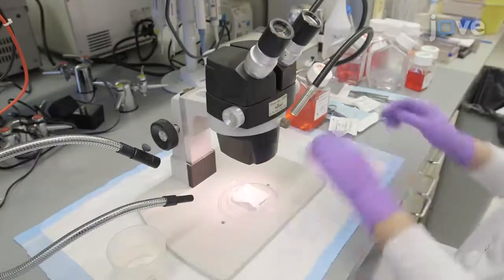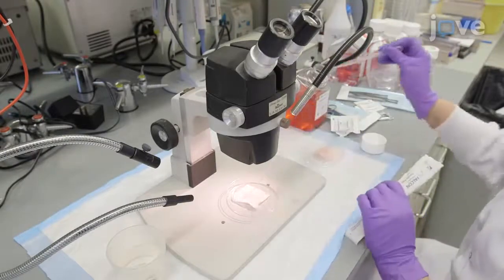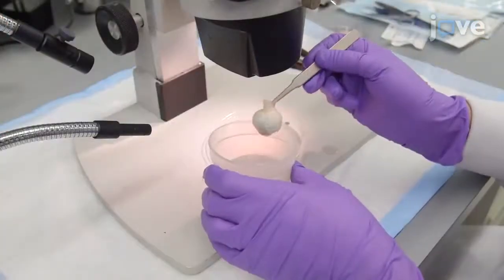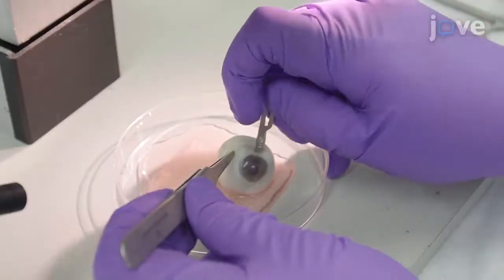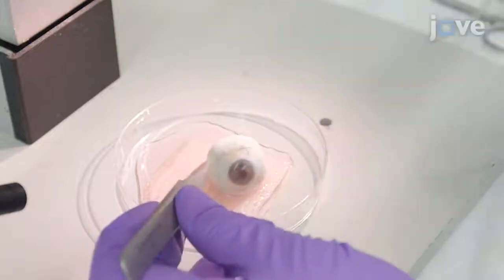To begin, place a 1.5 square inch gauze soaked in CO2-independent DMEM into a 100 millimeter dish, then load the eye globe onto the gauze. Next, use a surgical blade to make an incision through the sclera three millimeters posterior to the limbus.